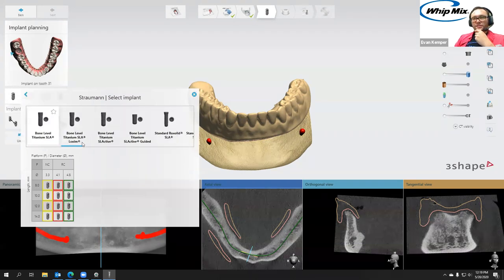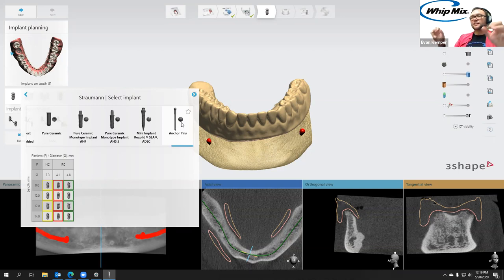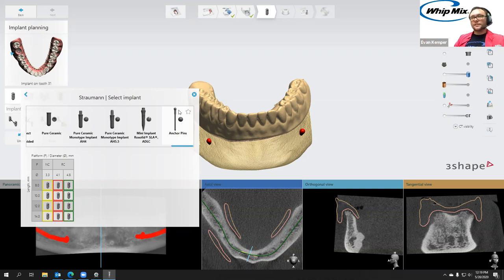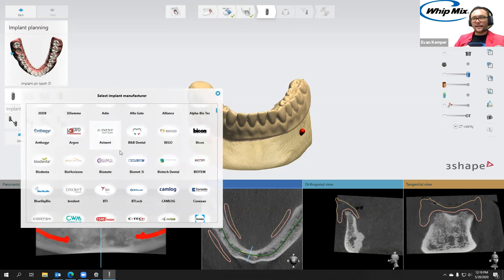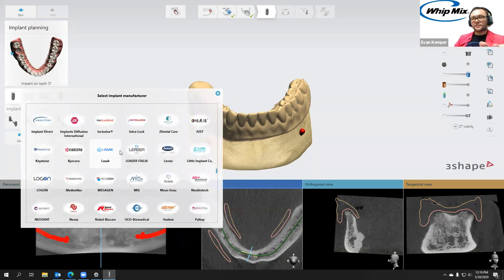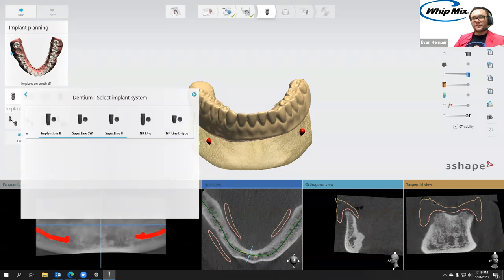One thing you'll notice in the edentulous workflow is that some manufacturers have anchor pins. The anchor pins are the additional thing we'll add beyond just the implants — during surgery they're actually going to anchor this guide to the jaw, since we don't have teeth to lock it in; we're actually going to lock it into the jawbone itself. I'm going to stick with the Dentium library — if I wanted to change I can go back and pick from any I've downloaded.